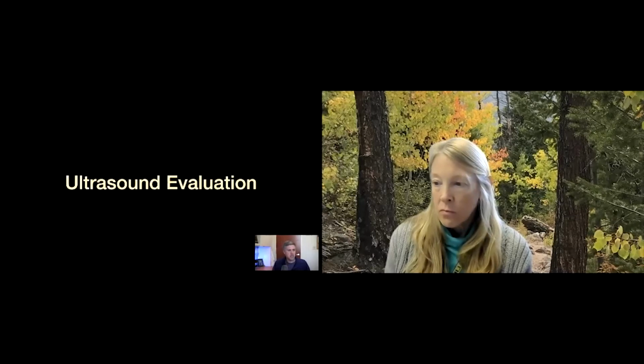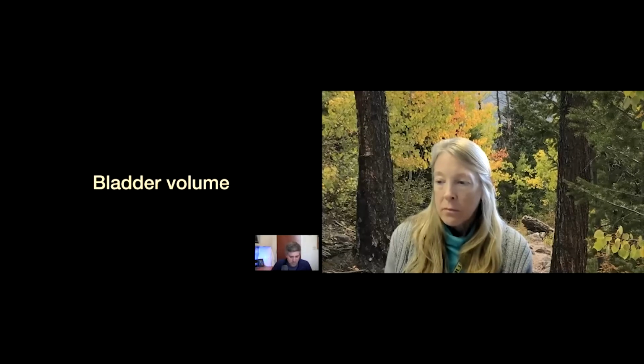So switching gears, let's talk a little bit about how we evaluate this from a sonographic standpoint, right? What are we going to do when we do the ultrasound, and what are we looking for? What images do we need to get, right? So one of the goals of this discussion on urinary or bladder ultrasound is to assess bladder volume. That's why we do what we're doing. We're looking to see how big this thing is, to say, do I need to intervene upon this? Do I need to help drain it, or is it draining itself, or am I not even producing enough urine, right? So that's going to be the main goal.